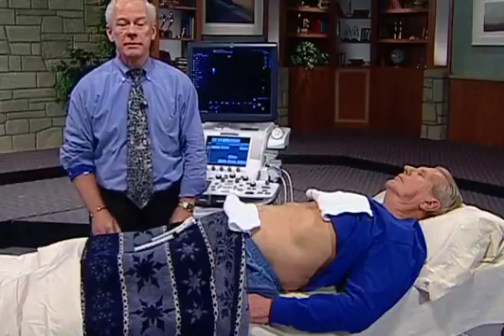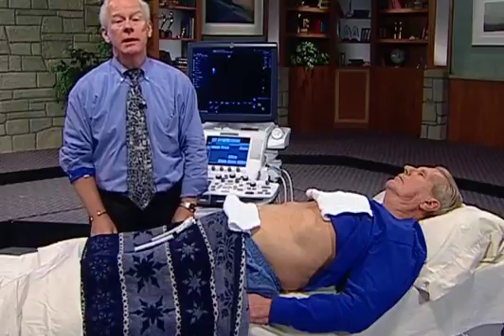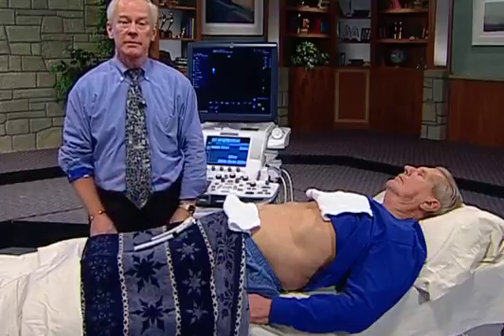Let's show an actual demonstration of the principles of the aortoiliac duplex evaluation. We have with us a real patient, which is helpful. It will show a lot of the principles in this particular examination.